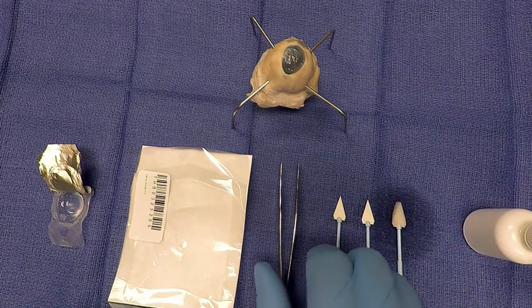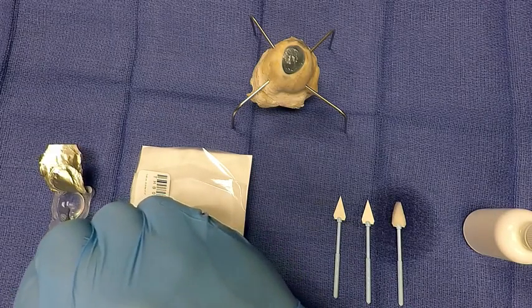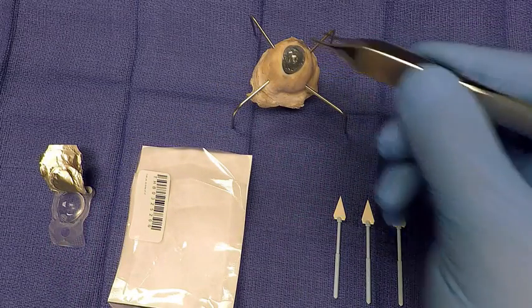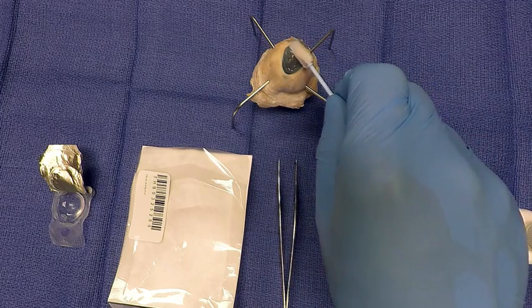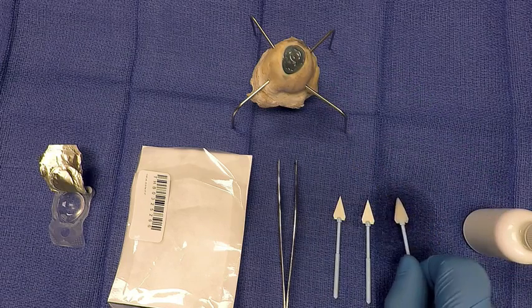Finally, take your preferred bandage contact lens and place it over the amniotic membrane to create a barrier or bandage to keep the membrane from migrating. Using the soft cell sponge, smooth out any bubbles that may be under the surface of the contact lens. The surgeon can then place an antibiotic drop over the eye if preferred. Using this antibiotic drop will not affect the properties or healing process of the amniotic membrane.